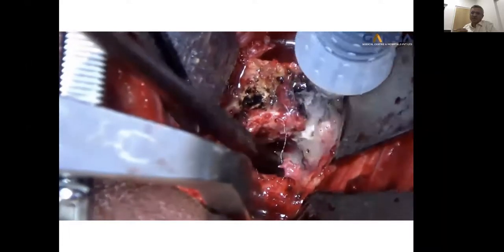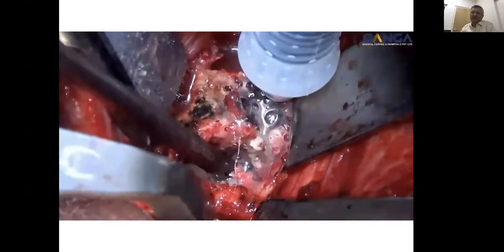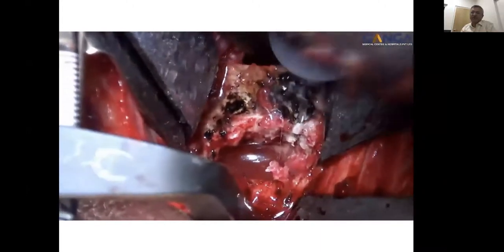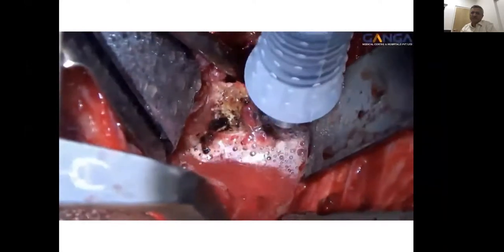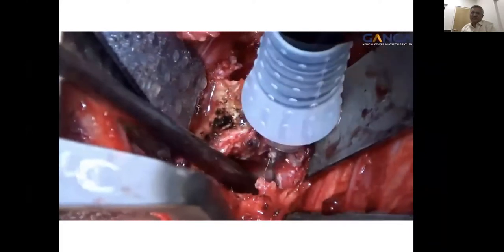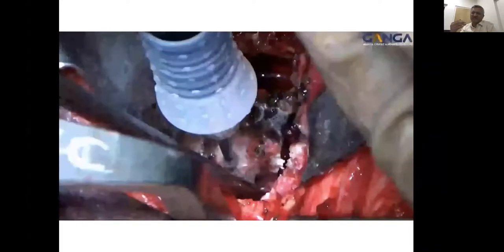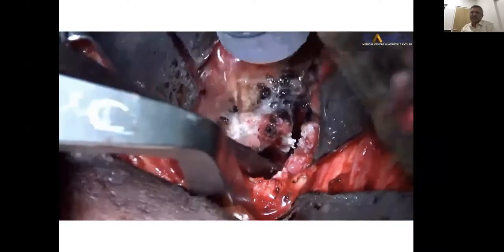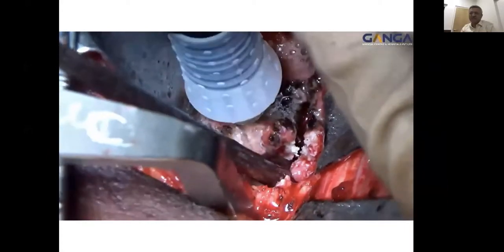See the amount of irrigation that is necessary to prevent the heat. And you need to have a blade of a much longer length so that you can perform the corpectomy much, much safer. To get a feel of sensation as you are reaching the anterior cortex, as you cut through the cancellous bone, that is the anterior rather than the posterior cortex in this particular scenario.